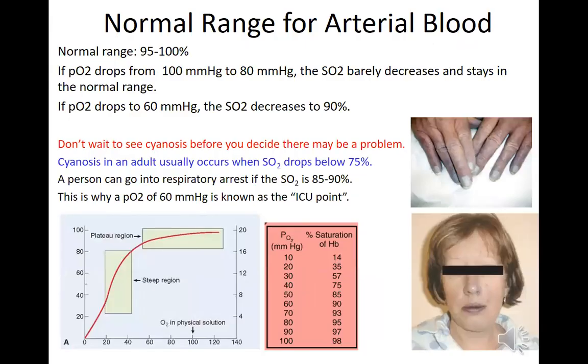So this is showing you somebody with cyanosis. Blue nail beds, blue lips, blue around the sclera maybe. But again, like I mentioned before we used pulse oximetry, you'd wait for this before you gave supplemental oxygen or realized that the patient was in respiratory distress. So now at least you can monitor with the finger pulse oximetry with SpO2, right? You don't have to draw any blood, you put it on, you can monitor, see changes.